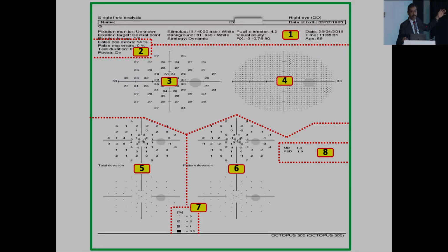It is okay because you will have the data somewhere else. But you have to understand, once you have the visual acuity 6/6, if the foveal threshold values are very less, then it is important. There is something wrong going on. Then you have the glass powers mentioned properly. So that is zone 1.